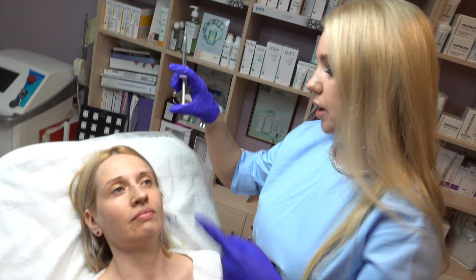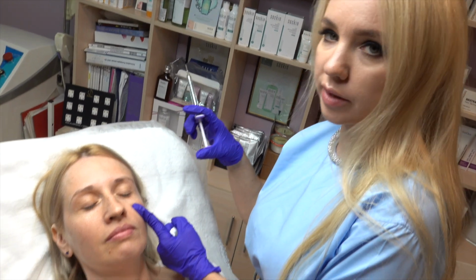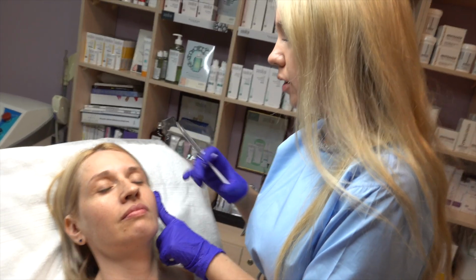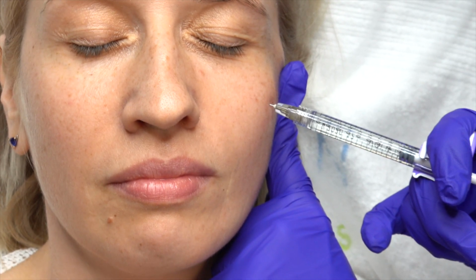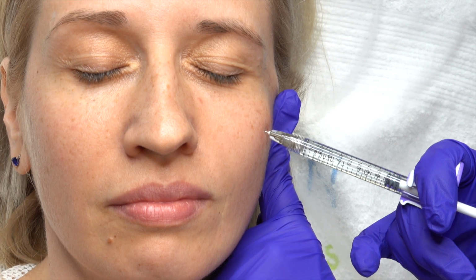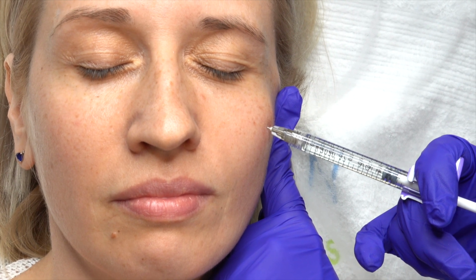Now I switch to overlift, and then I will go to this point. You remember where the midcheek groove is? Now I switch to overlift and then go here to support the zygomatic ligament and orbital retaining ligament. And here I want to inject 0.2.